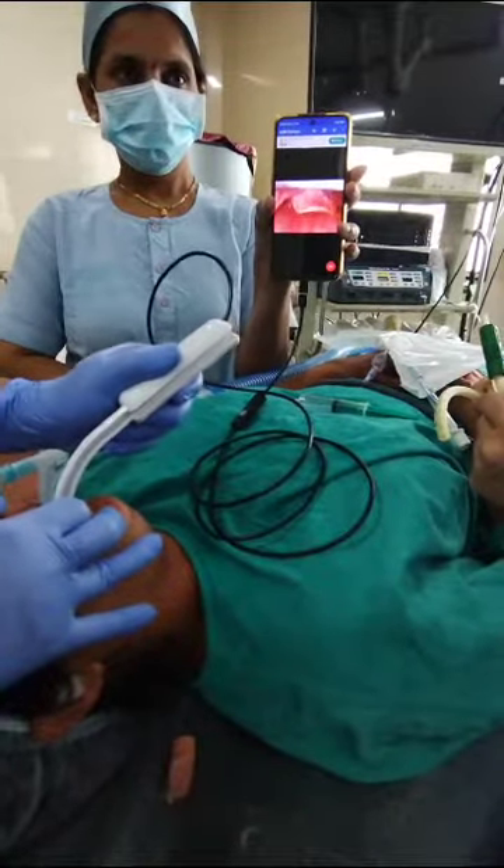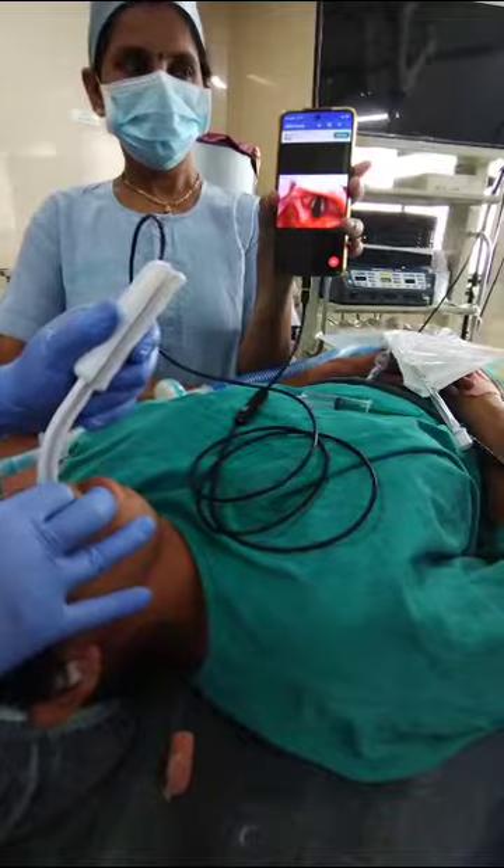Walking over the tongue, the epiglottis is seen. Just lifting up of the epiglottis, and the vocal cords are seen.